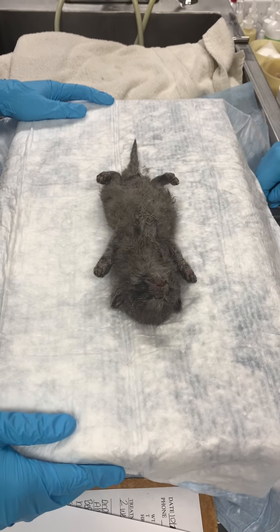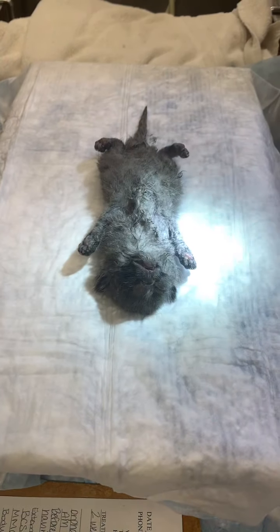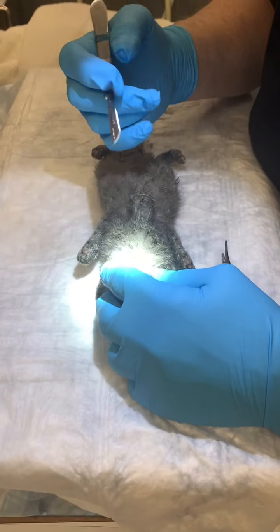Okay, now we are ready to perform our necropsy procedure. So my DVM will begin to prosect.